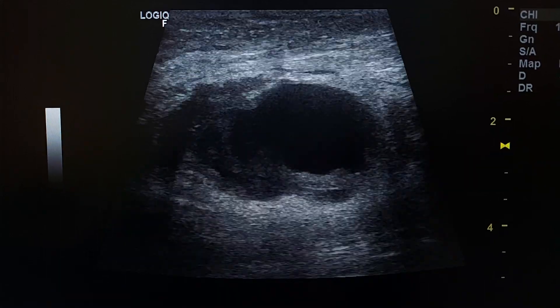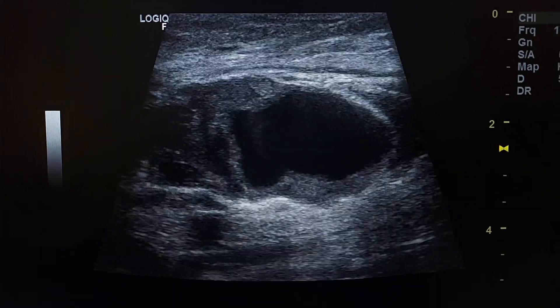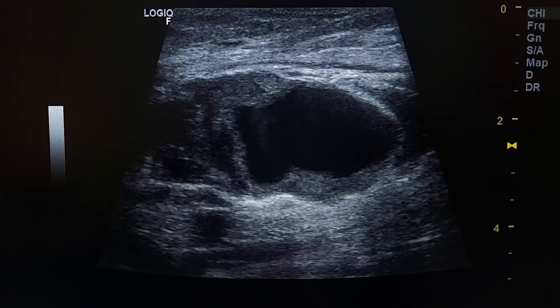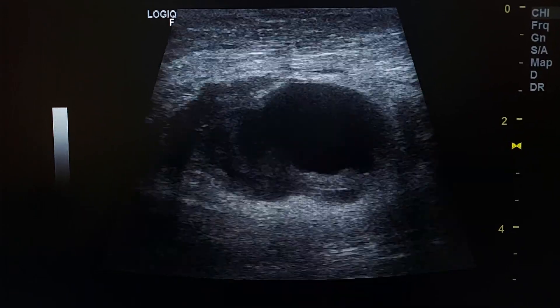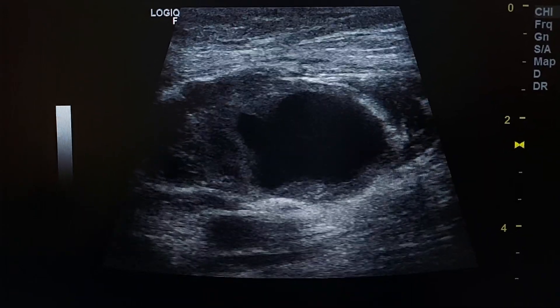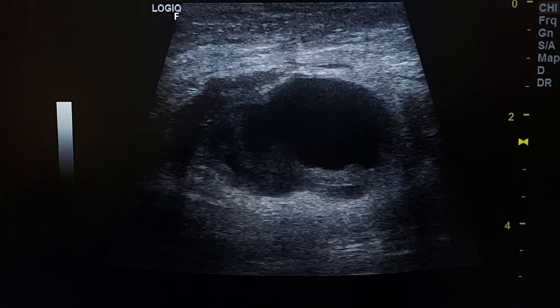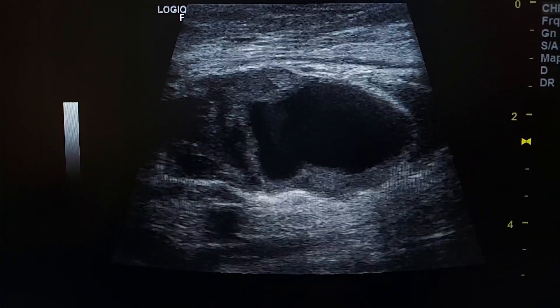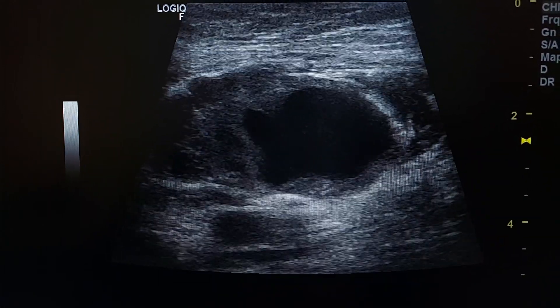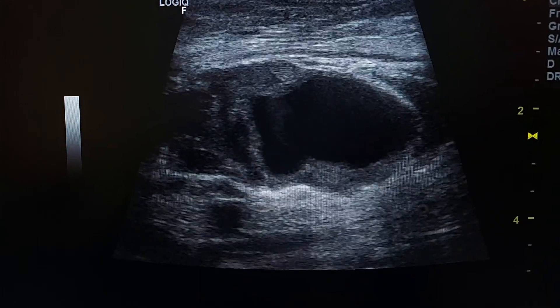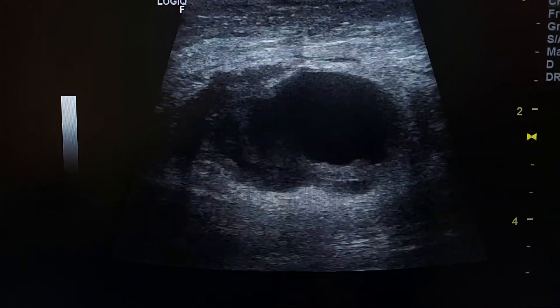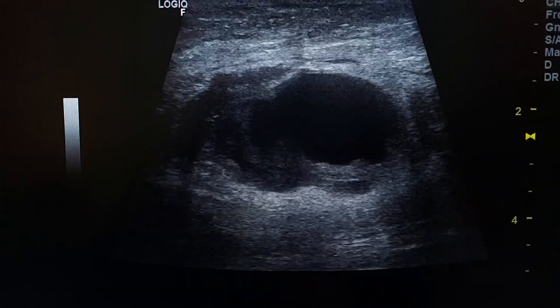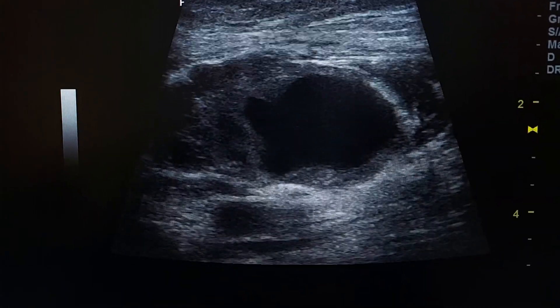This is a pseudoaneurysm of the superficial femoral artery in a patient after cardiac catheterization. There is a bulge in his upper thigh, and here we see the lesion with the linear probe.